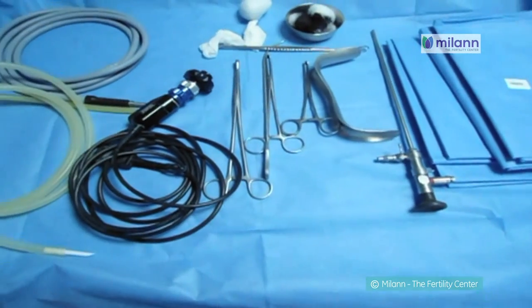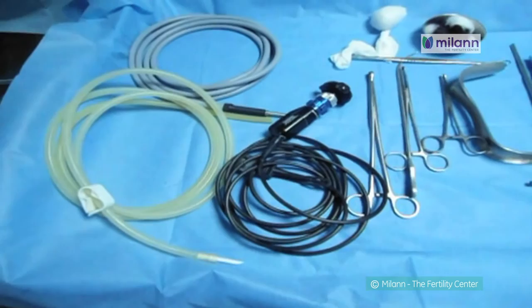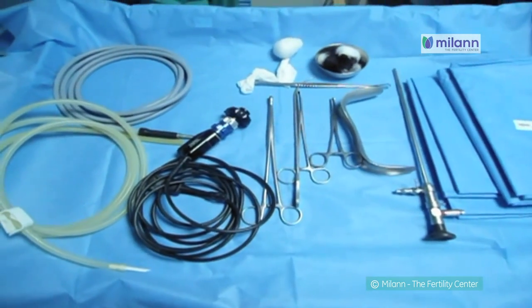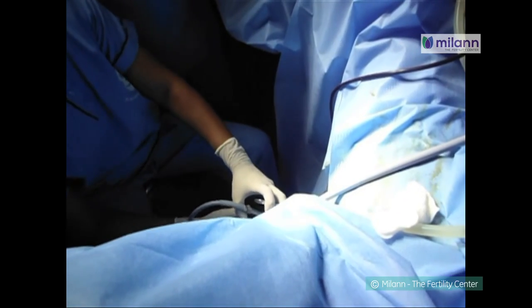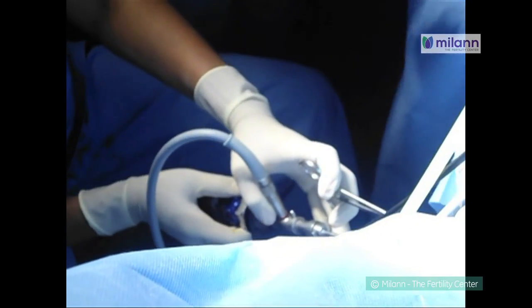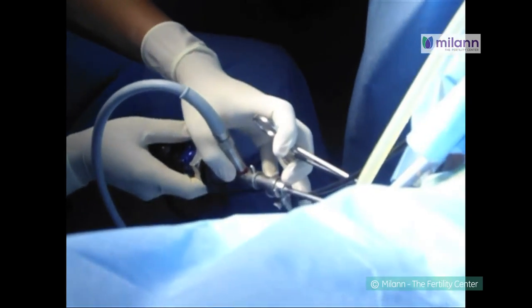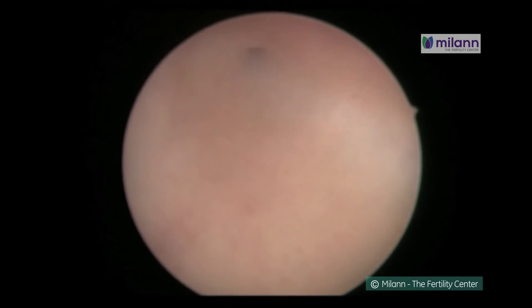The hysteroscope is inserted through your vagina and cervix into the uterus. A liquid solution is then inserted into the uterus through the hysteroscope to expand it and clear away any blood or mucus. Next, a light shown through the hysteroscope allows your doctor to see your uterus.